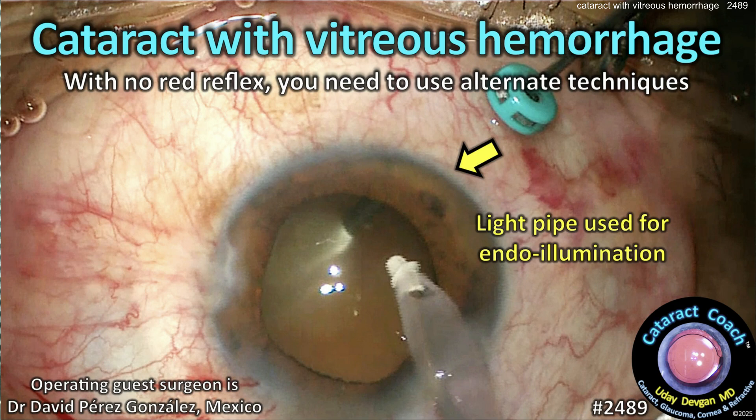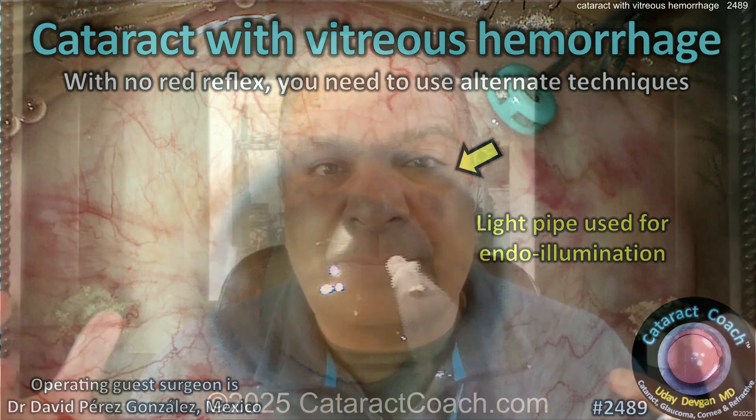Cataractcoach.com: cataract surgery with a vitreous hemorrhage — there's no red reflex. How do you complete the case? How do you see to do a capsulorrhexis? How do you see to remove the cortex? The vitreous hemorrhage is going to block all of that. Sure, you can use trypan blue dye to stain the anterior lens capsule so you can see the rhexis, but as you're removing the lens cortex and trying to strip it away, how can you be sure it's all gone without that beautiful red reflex?